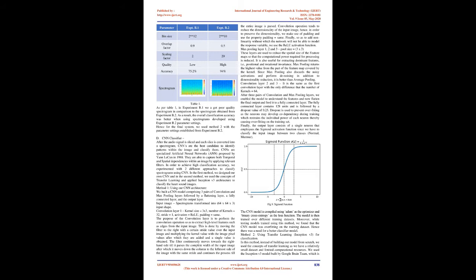Method 2, using short-time Fourier transform, STFT, and log scaling. In this method, we designed Python functions to read the audio file, perform short-time Fourier transform, STFT, of the audio and then perform log scaling and finally create an image file, .png. STFT is one of the most frequently used tools in audio analysis and processing. It describes the evolution of frequency components with time, and in order to compute it, the time signal is divided into shorter chunks of equal length, and then Fourier transform is computed on each segment separately. On plotting the changing spectra as a function of time, we get a spectrogram.